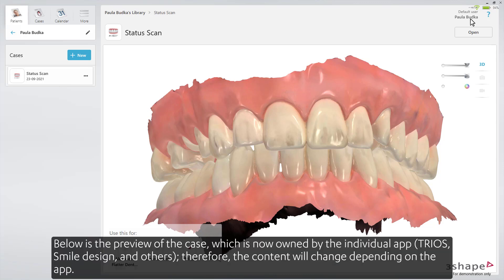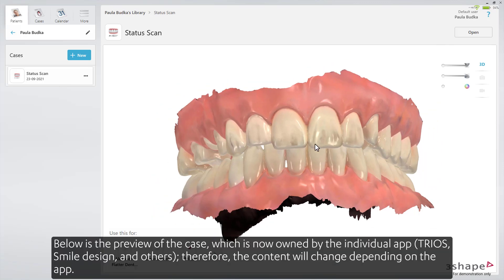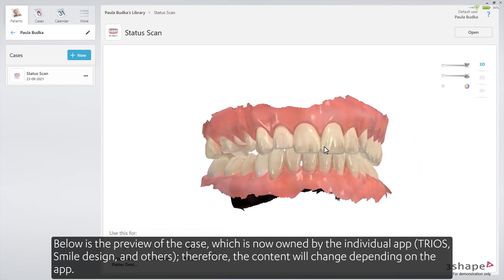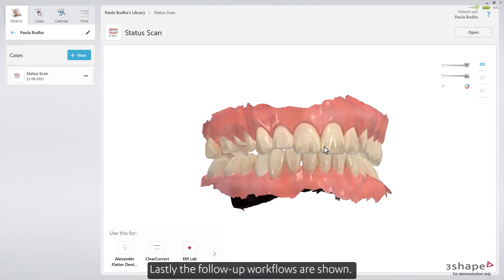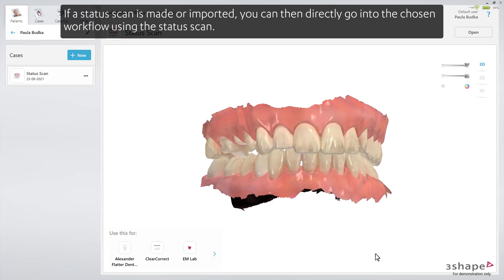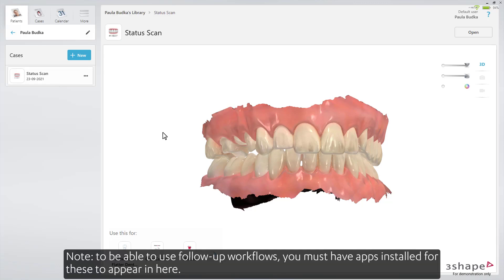Below is a preview of the case, which is now owned by the individual app — Trios, Smile Design, and others. Therefore, the content will change depending on the app. Lastly, the follow-up workflows are shown. If a status scan is made or imported, you can then directly go into the chosen workflow using the status scan. Note: to be able to use follow-up workflows, you must have apps installed for these to appear here.